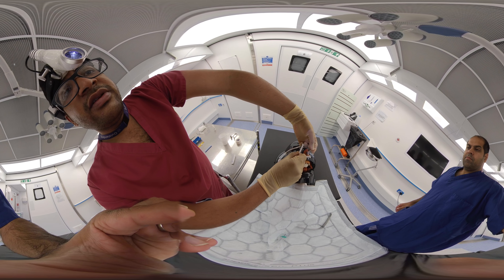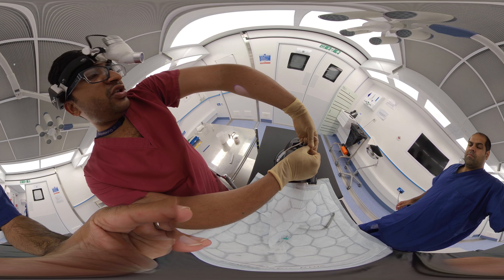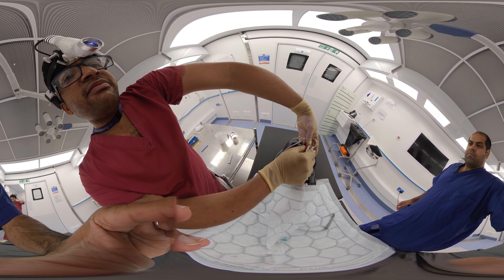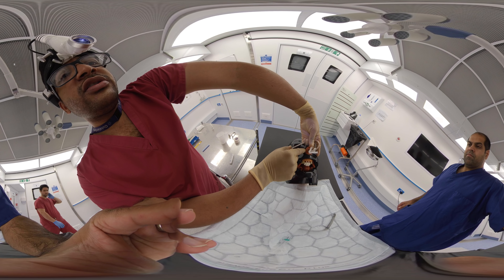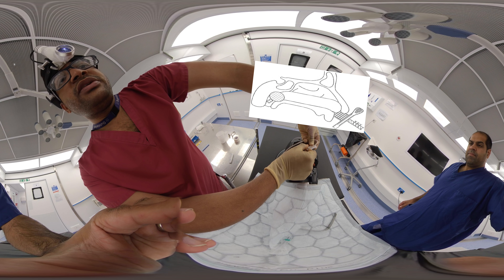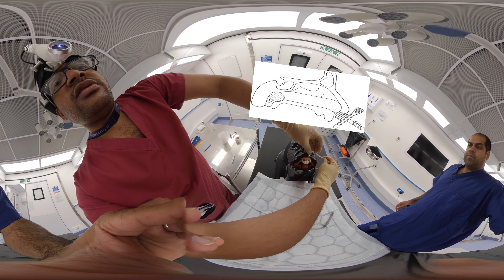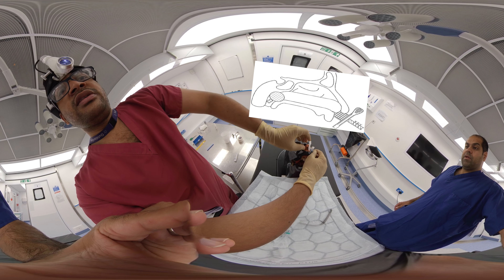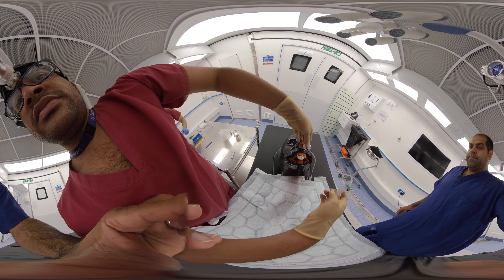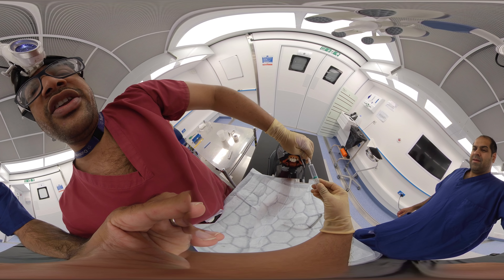Now we have to secure the post-nasal pack with the umbilical clamp, placing it just above the nostril. We should ideally keep some gauze between the clamp and the nostril to prevent pressure necrosis over the ala of the nostril, then clamp it and fix everything together. We should also inflate the rapid rhino.